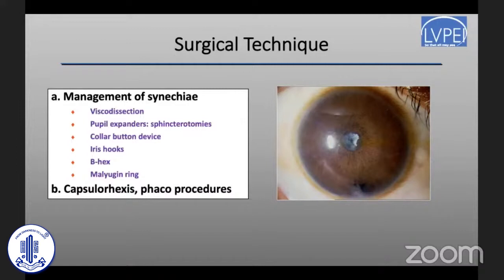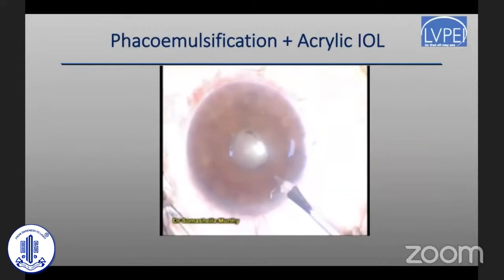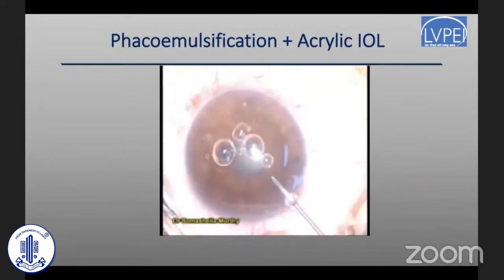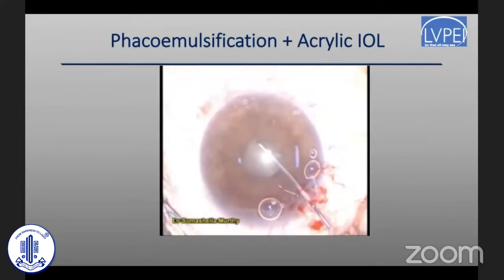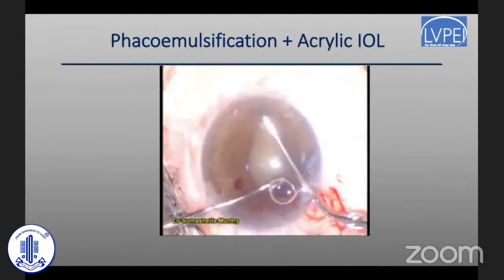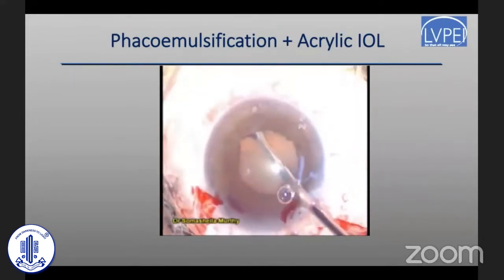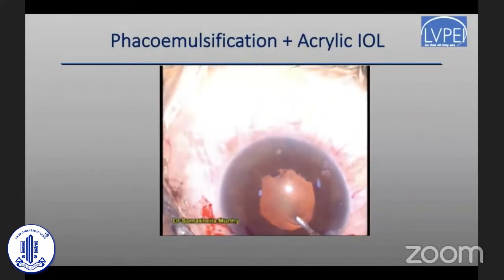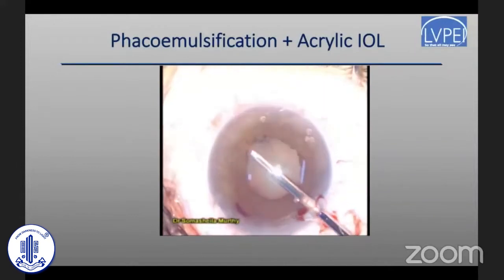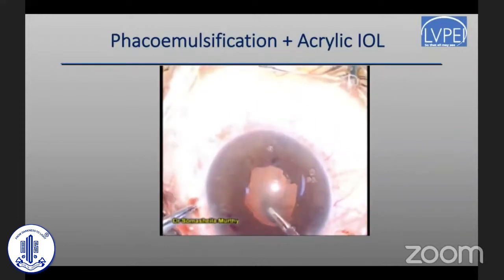This is a 35-year-old patient with VKH who had a complicated cataract and a very shallow anterior chamber. Notice that the patient has almost 360 degrees of posterior synechiae. After making the side ports and injecting viscoelastic, with the help of a Sinskey hook, a space is created between the anterior lens capsule and the synechiae. The pupil opens up a little, and further opening is done with Gublin's hooks very slowly, taking care not to rip the iris since it's very fragile in young patients.